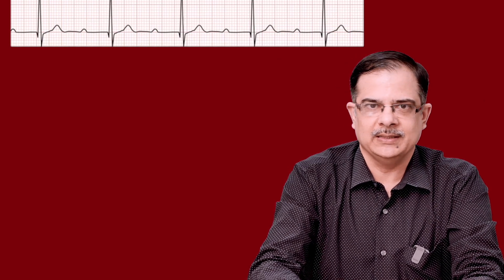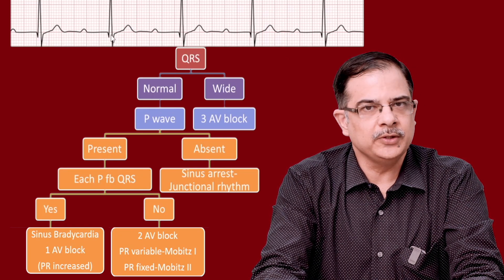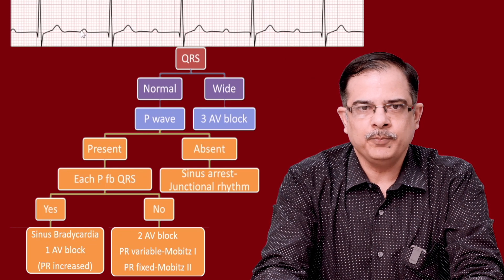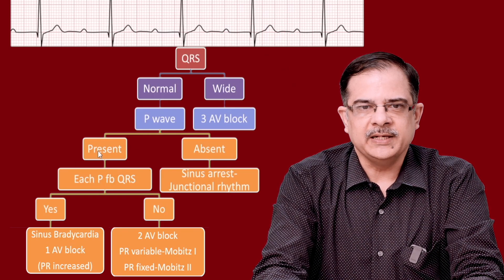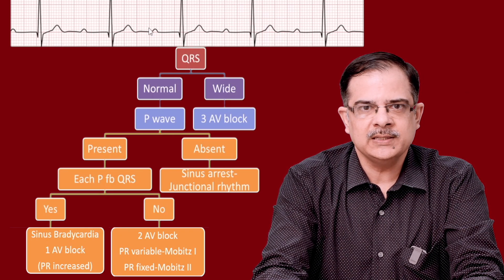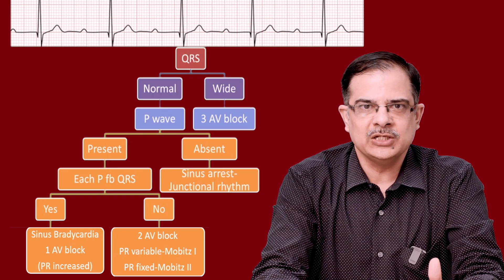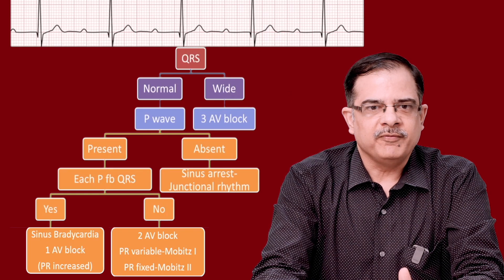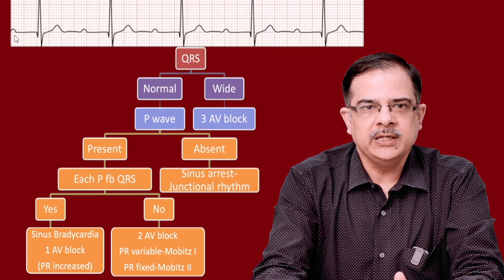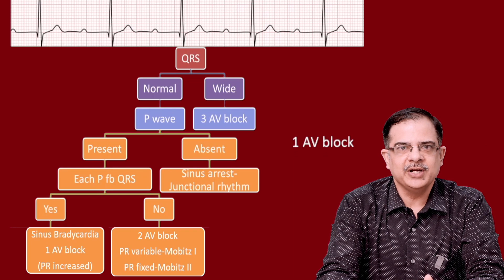Moving to the third ECG, applying the same flowchart: QRS complex is normal in breadth. P wave is present just before the QRS, as shown by the pointer. Each P is followed by QRS — yes. So there are two differential diagnoses: sinus bradycardia or first degree AV block. In first degree AV block, PR interval will be more than 5 mm or more than one big square width. Here the PR interval is more than one big square width, so the diagnosis is first degree AV block.